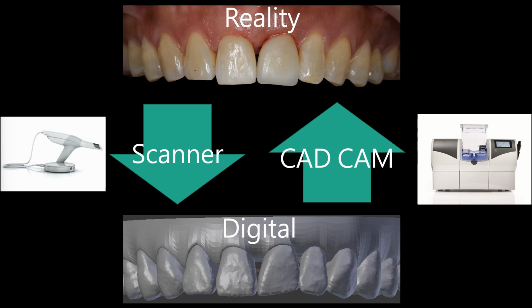Nowadays we see a lot of digital dentistry, including prosthodontics, implantology, and restorative operative dentistry. We have a patient in reality, and we use an intraoral scanner to transform the patient information from reality to digital. Later we design our prosthetics, like a single crown or bridge. After we design that in the digital world, we use CAD/CAM, computer-aided design and computer-aided manufacturing, like this machine, and we put the digital information back to reality.